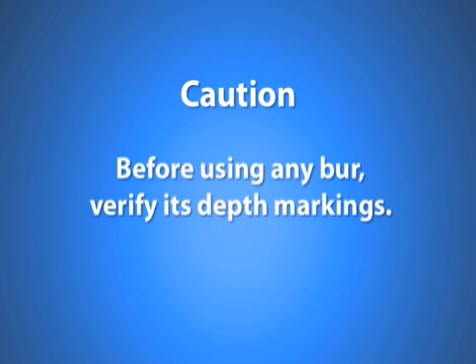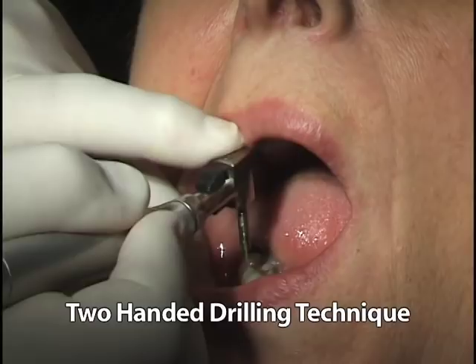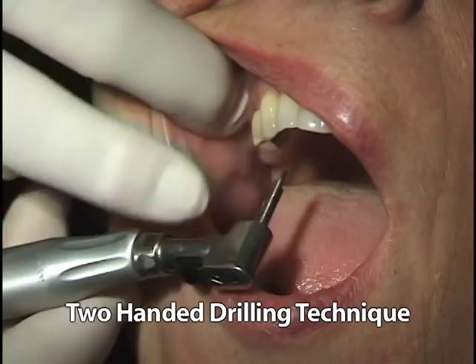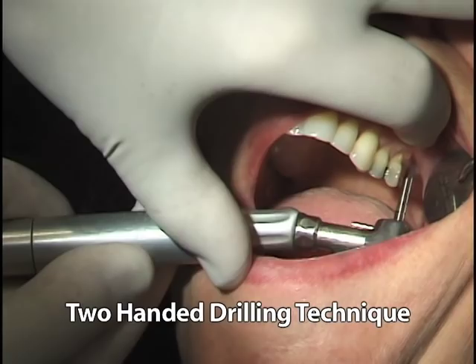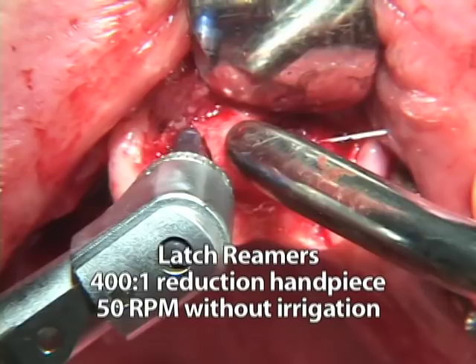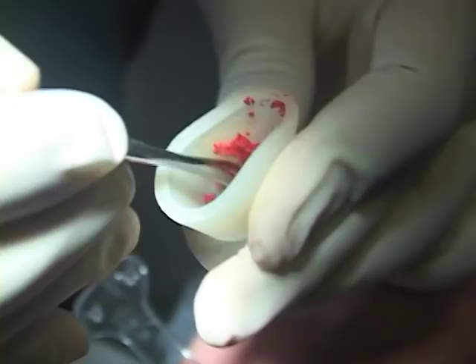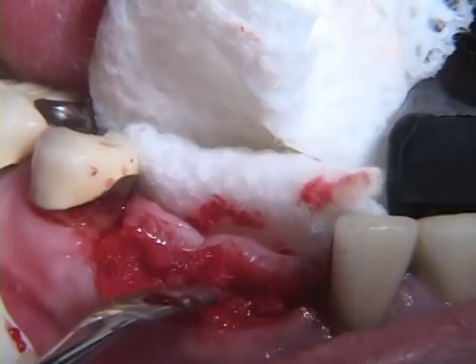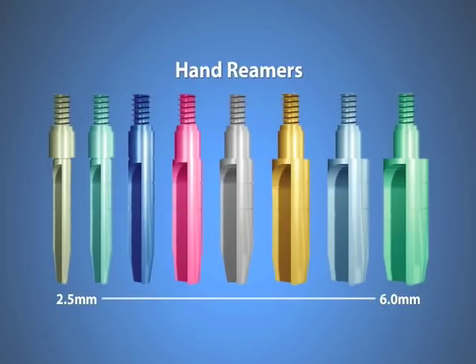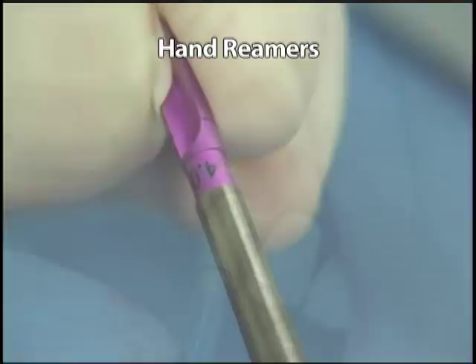The latch reamers are best used in a two-handed drilling technique. While one hand guides the trajectory of the drilling, the other hand applies the apical inserting and coronal withdrawal force. In order to prevent bone shavings from clogging the flutes of the reamers and overheating the walls of the osteotomies by burnishing, the reamers, while continuing to rotate, are intermittently withdrawn from the osteotomy for the harvesting of bone from their flutes. The harvested bone is collected in a flexible silicone dappen dish for its use as an autogenous graft over the seated implant. Alternatively, hand reamers threaded on a straight handle may be used to widen maxillary pilot osteotomies.